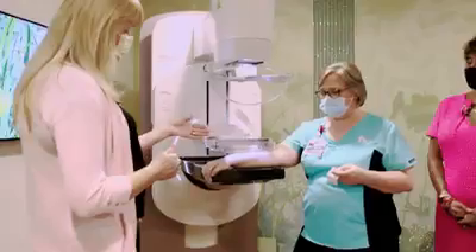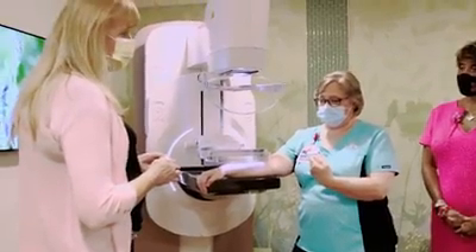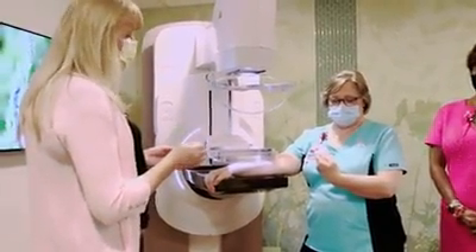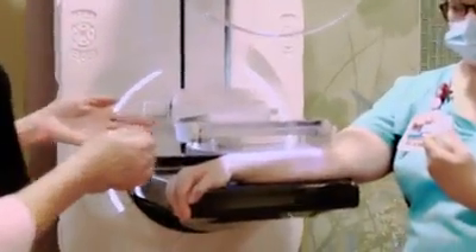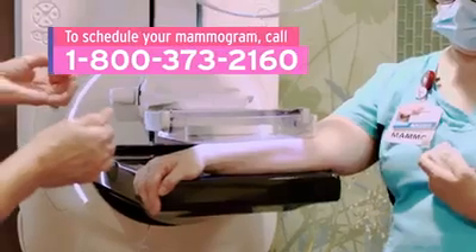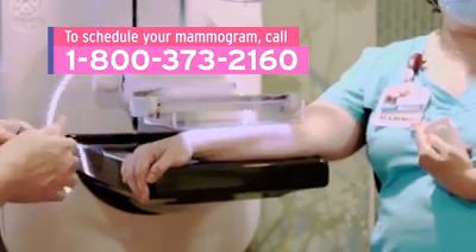The technologist starts the compression, and then you have a remote control and you finish the compression. You can do it by just one click at a time, or you can press down and it'll continue to compress. If it gets to be too much, you have a couple of opportunities to click and it will release a little bit of that pressure.